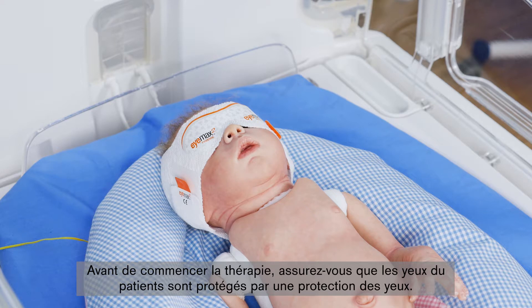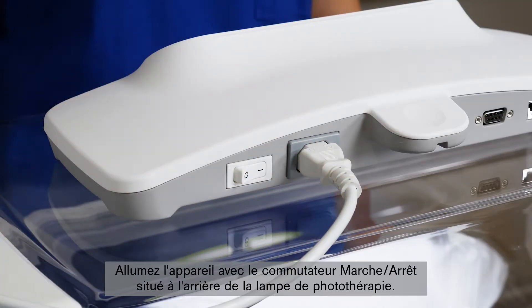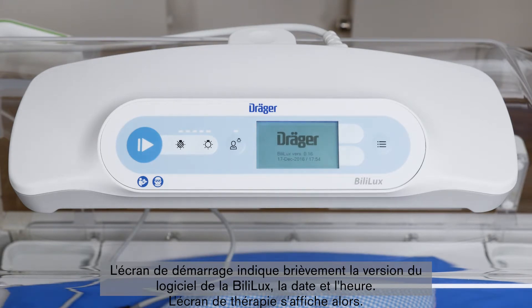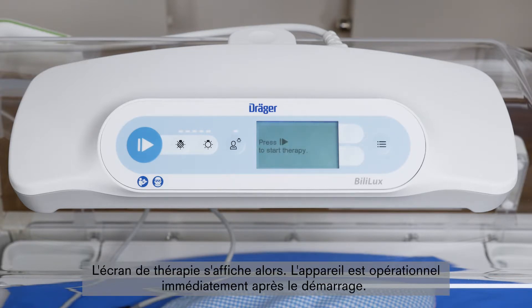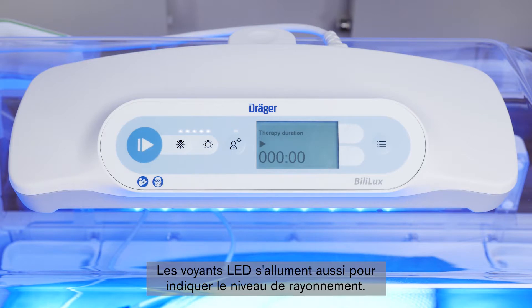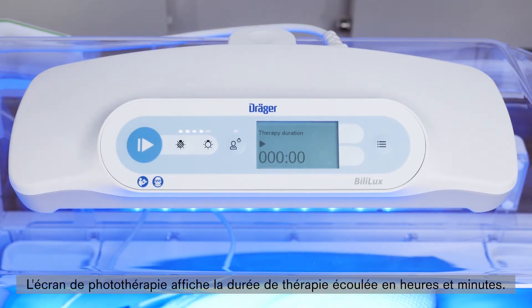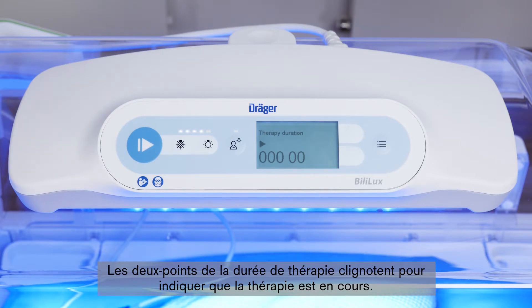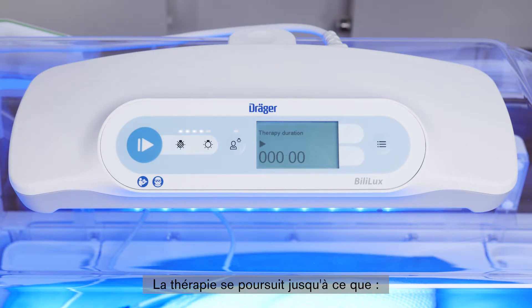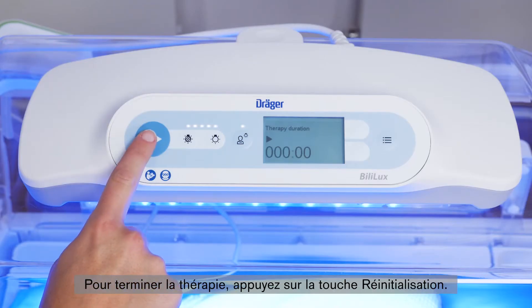Before you start phototherapy, make sure that the patient's eyes are protected by eye shields. To switch on the device, use the on-off switch located on the rear of the phototherapy light. The screen briefly shows the start-up screen, which contains the Bililux firmware version and the current date and time, then proceeds to the therapy screen. The device is ready for use immediately after start-up. Press the start key on the control panel to turn on the phototherapy light. Adjust the irradiance to the desired level using the irradiance keys. The phototherapy screen shows the elapsed therapy time, with the colon blinking to indicate therapy is in progress. Therapy will continue until it is paused or ended by the user, the device is turned off, or the device loses power. To end therapy, press the reset button.